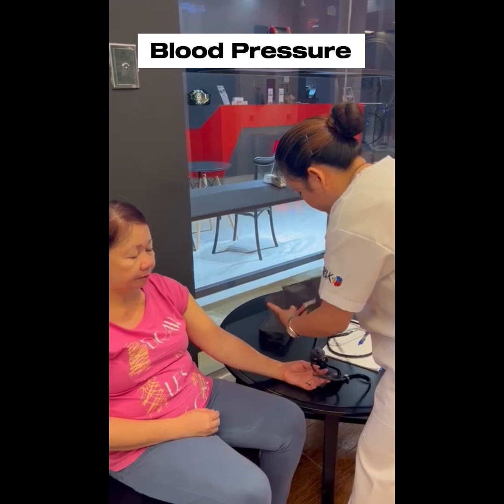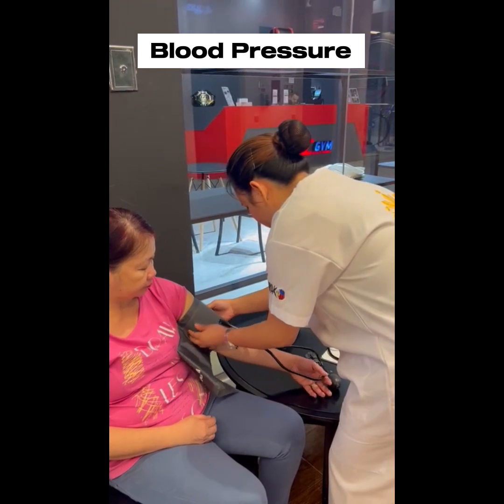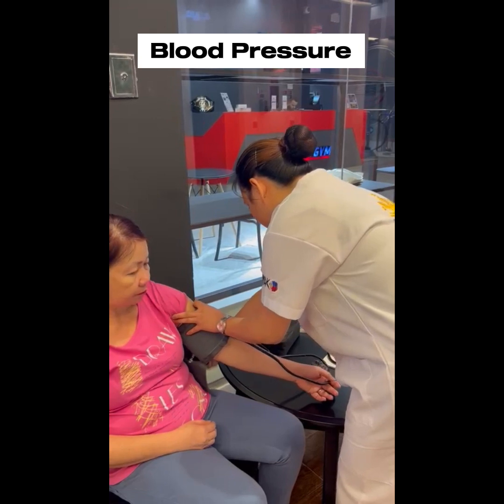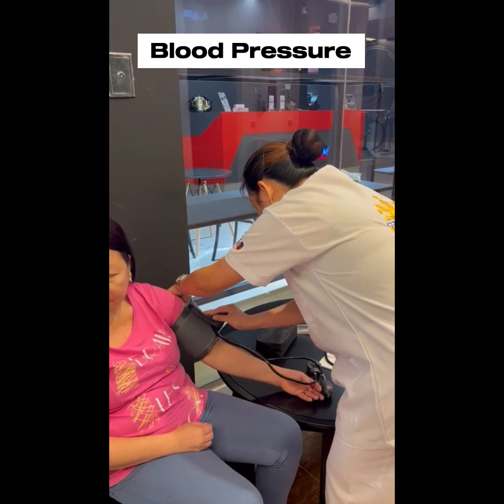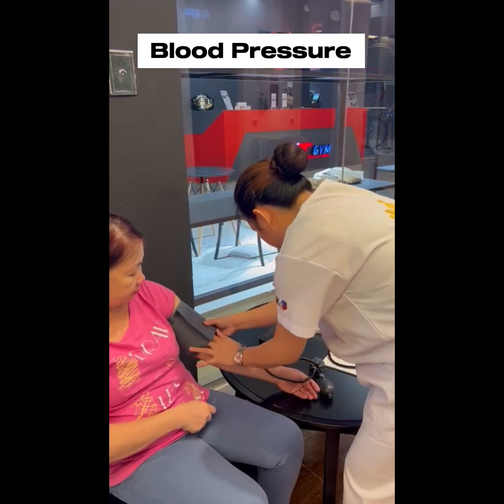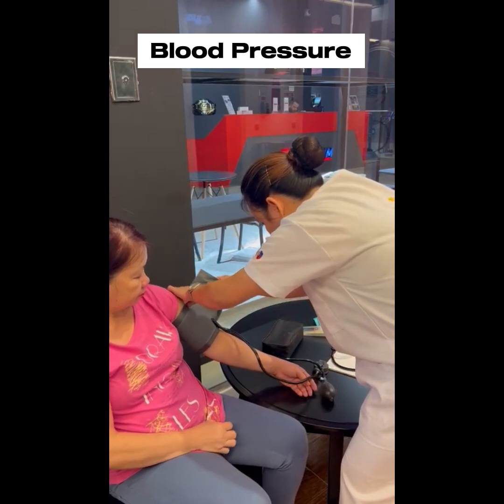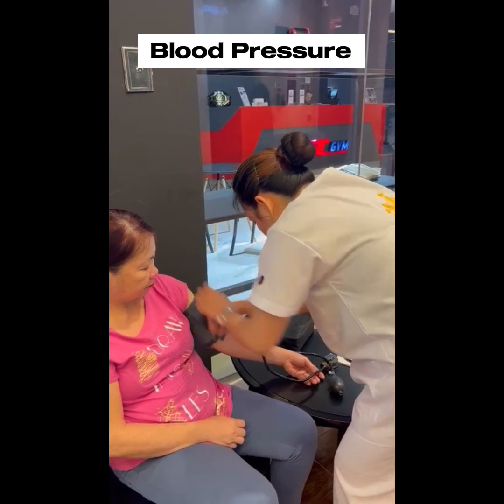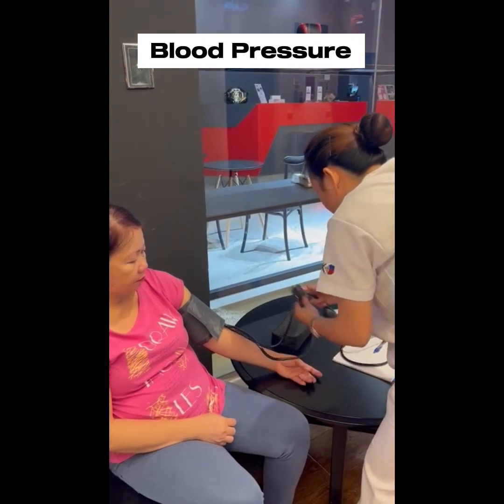Blood pressure. In taking the blood pressure, assist the patient. Remove and rearrange clothing to expose the area where the cuff will be applied. This is to avoid any disturbance when taking blood pressure. Place the cuff approximately 1 to 2 inches above the inner aspect of the elbow with the bladder over the brachial artery. Arrange the manometer gauge at eye level. This is to ensure an accurate reading.